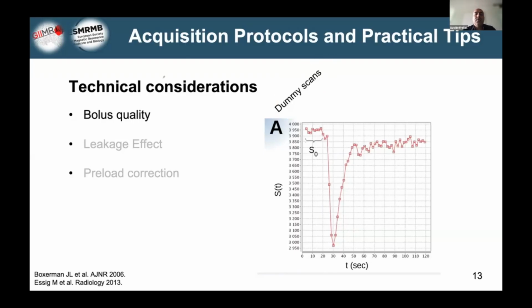They are initial radio frequency excitations acquired before the actual data collection, which are not stored or used for analysis, but bring the magnetization to a steady state equilibrium in favor of a better baseline and a better curve.